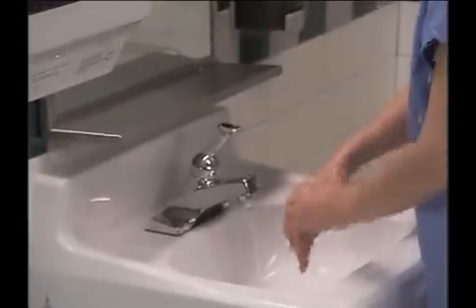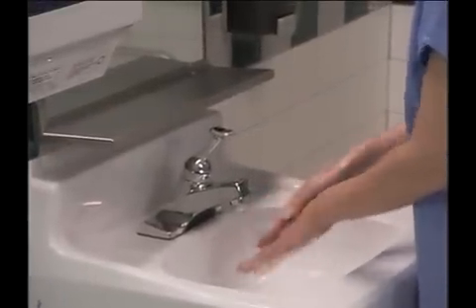Then, complete your finishing up steps as described in the final section of this video. For safety, always transport feet first and never leave the person alone on a stretcher. To transfer a person from stretcher to bed, you will reverse the procedure, making sure to observe all safety precautions.